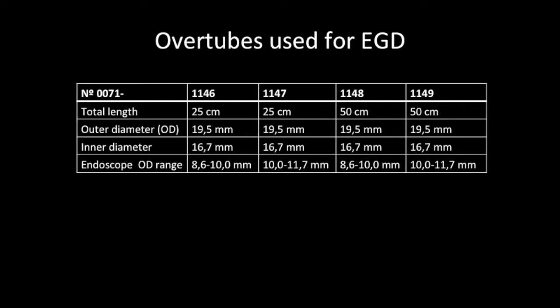Several tubes are available for use in therapeutic endoscopy. We used a gastric overtube — Guardus overtube, esophageal — with an inner diameter of 16.7 mm, outer diameter of 19.5 mm, and 50 cm in length, from US Endoscopy, Ohio, USA.